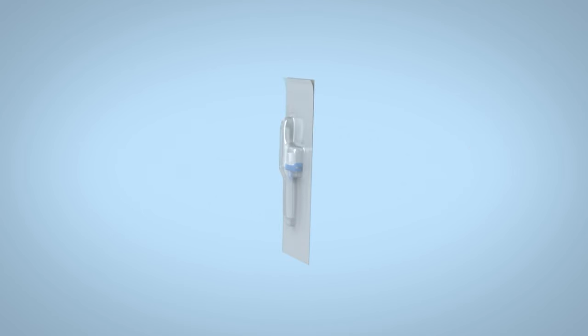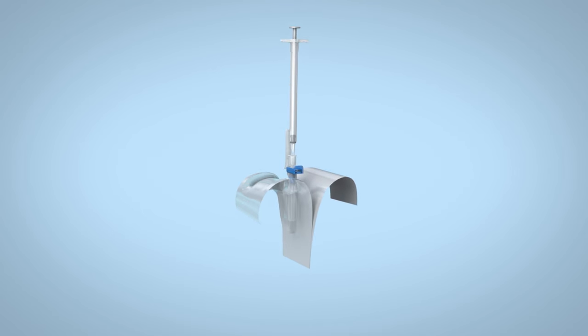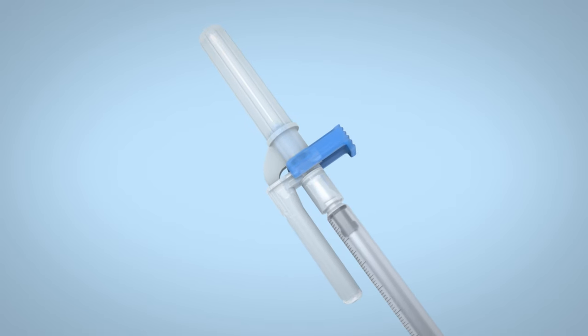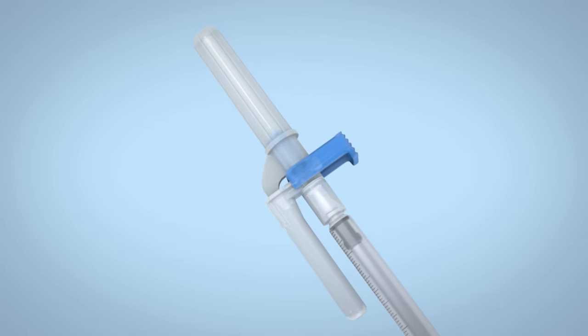Using aseptic technique, open the package and securely attach the EasyPoint needle to a syringe. The needle cap is designed to prevent inadvertent activation of the retraction mechanism.